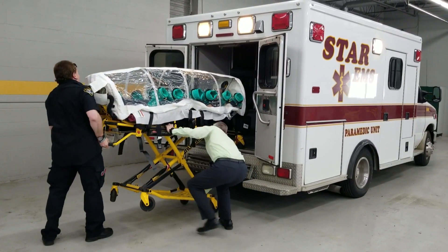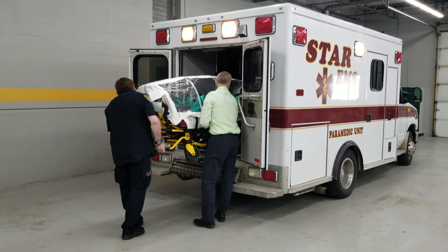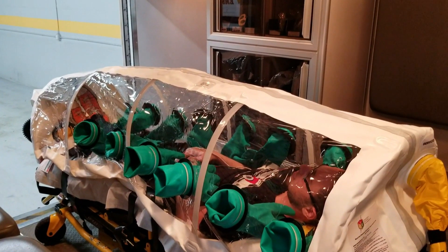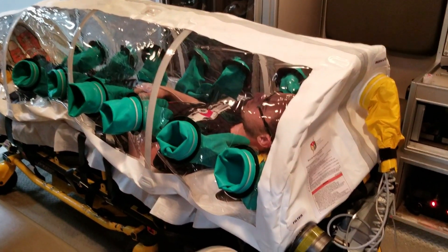We transport the patient in a manner that protects the care providers and also our ambulance from contamination, so that everybody can quickly return to service and serve the community and not become a casualty of the incident.